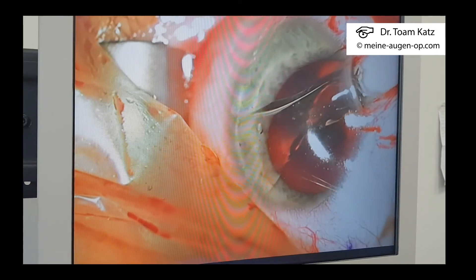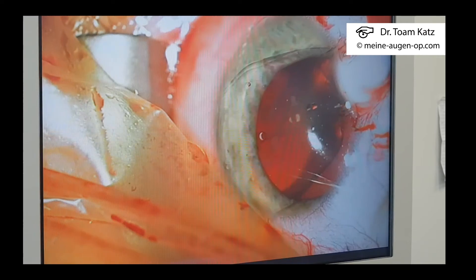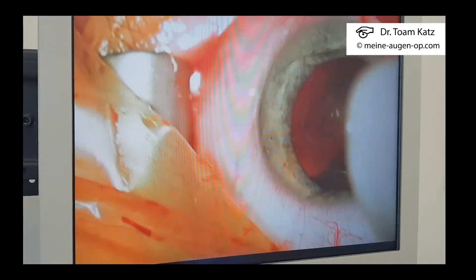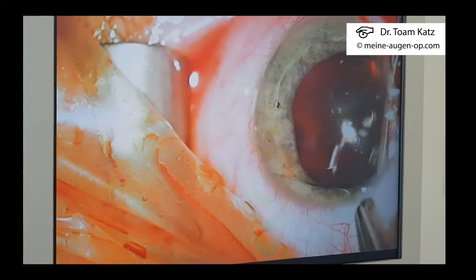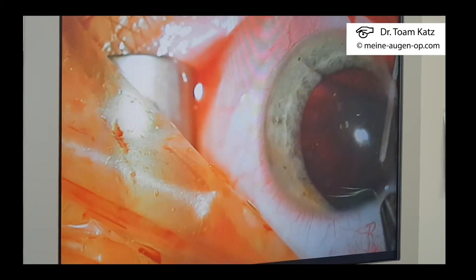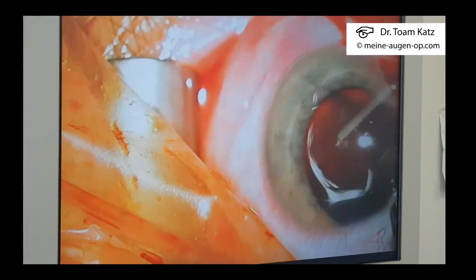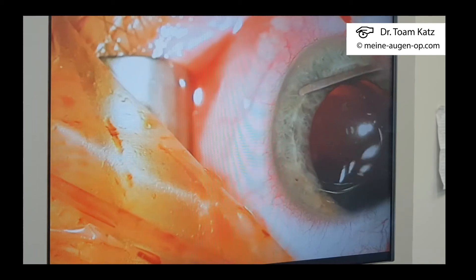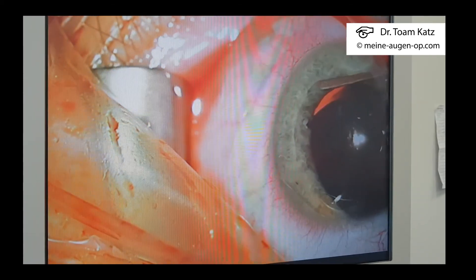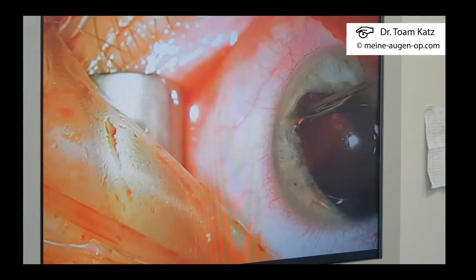After the lens is fully explanted, we can implant the bigger lens in the normal routine in one procedure. The lens looks very large compared to limbus to limbus, and we can carefully tuck the four haptics in the normal technique. In this case, we do not need to constrict the pupil afterwards. The lens has to be rotated as a toric lens to the pre-marked position, which was done without any specific problem.